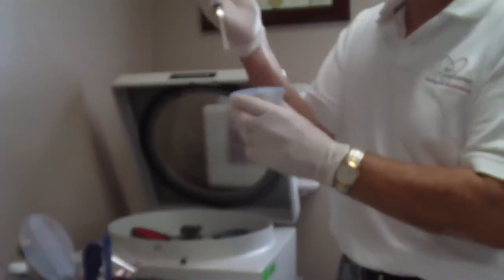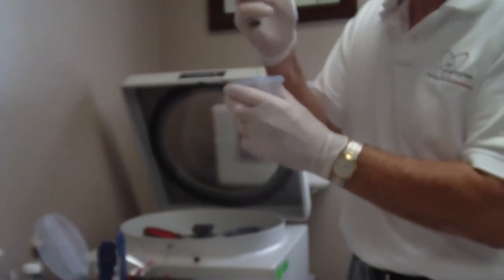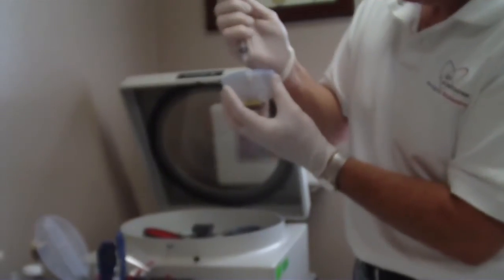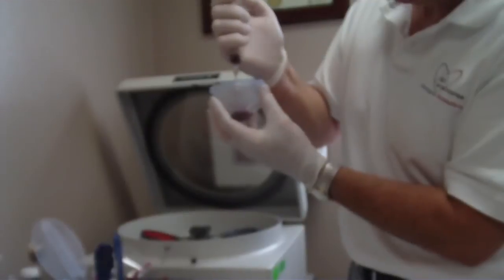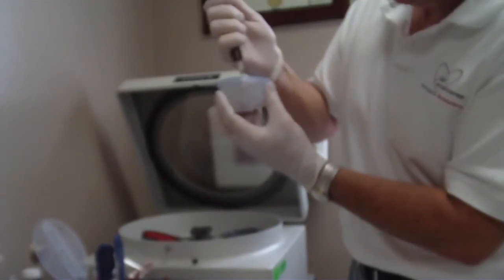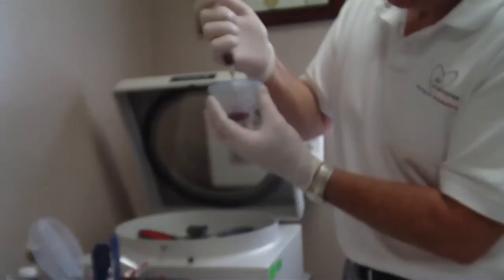With this second syringe, we'll go down and actually mix this solution up. I'll pull this up and then spray it back together and mix the solution — kind of like that.